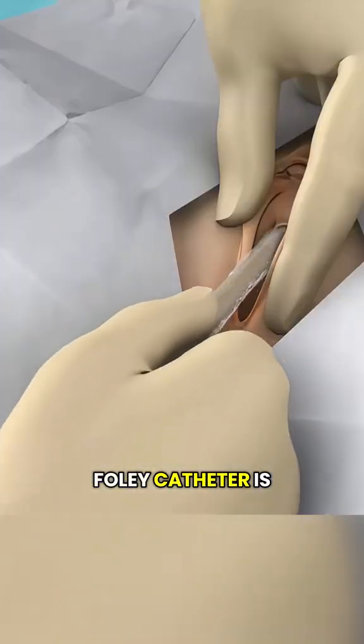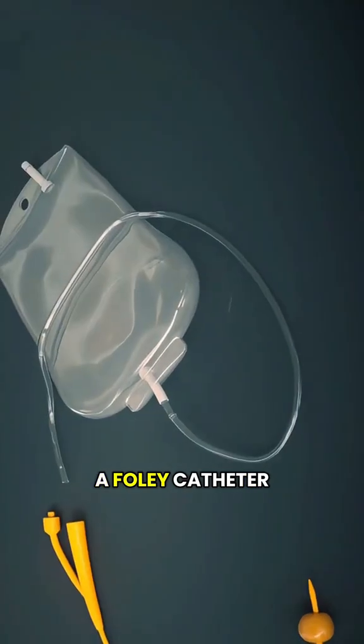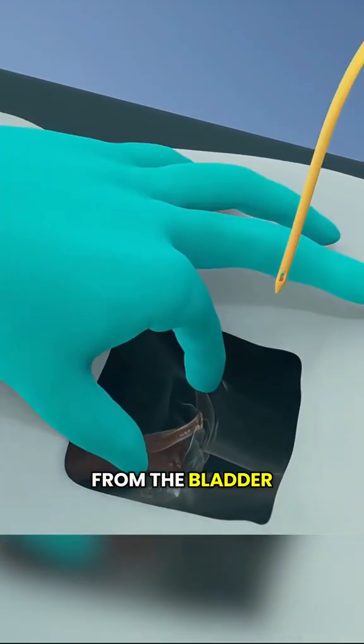Have you ever wondered how a Foley catheter is inserted in women? Let's go through it step by step. A Foley catheter is a thin, flexible tube used to drain urine from the bladder. Here's roughly how the procedure works.